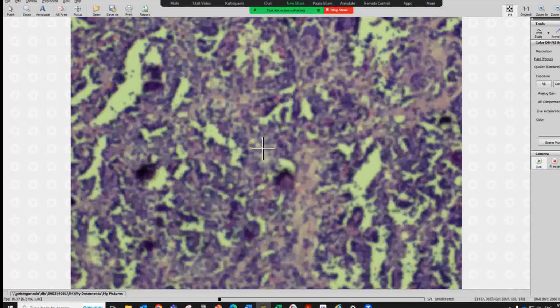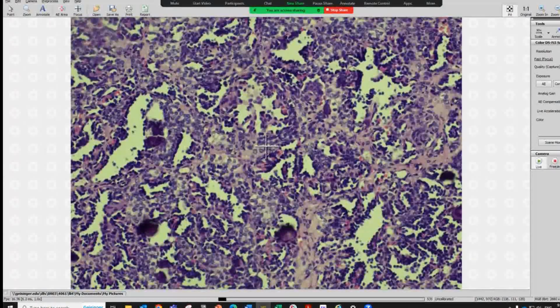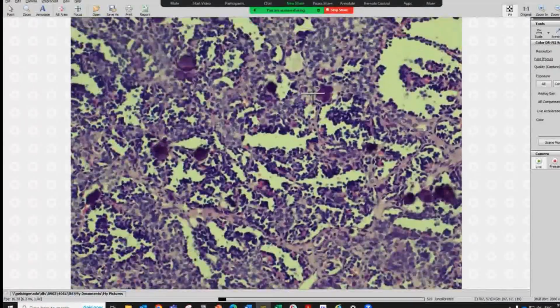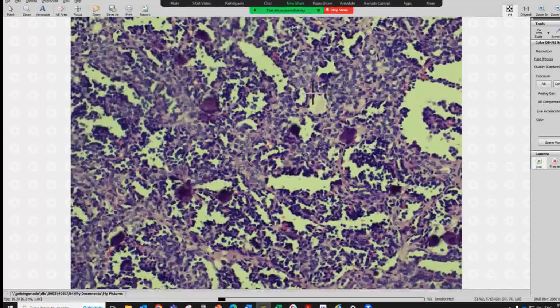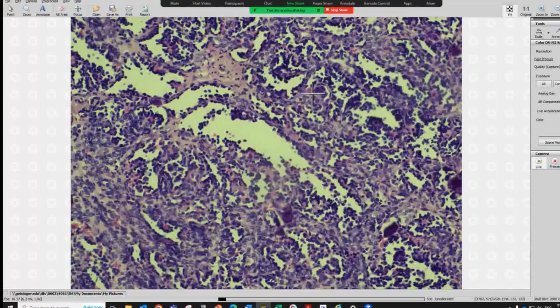And then we can see this kind of cell. They are not spindle shaped, but they have a little bit of nuclear molding with minimal cytoplasm, so they are good for blastemal cells. We can do some immunostaining to prove this is a Wilms tumor, but at least we can find two components: the stroma and some blastemal component.